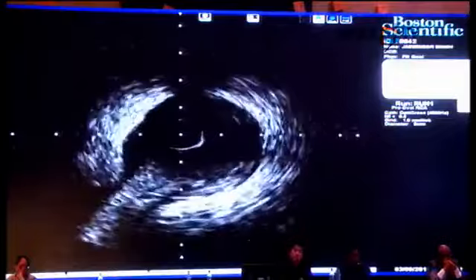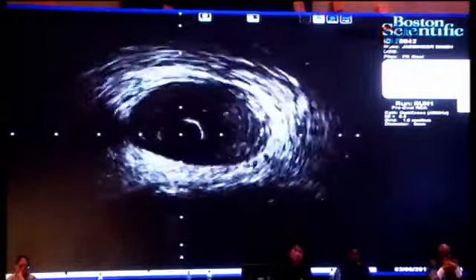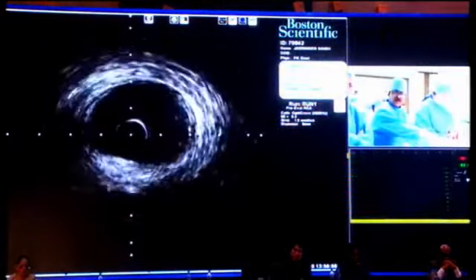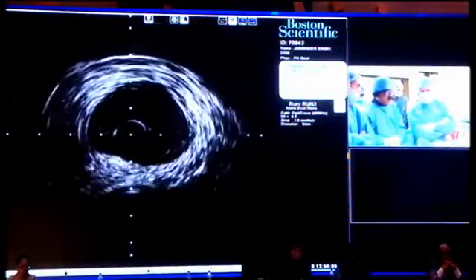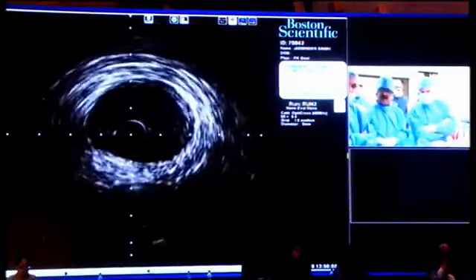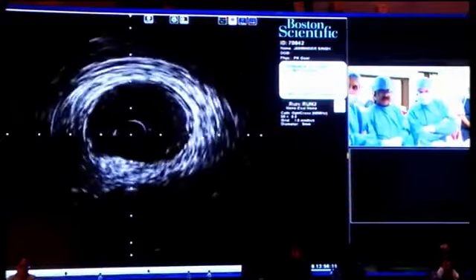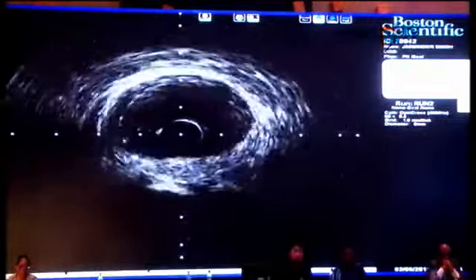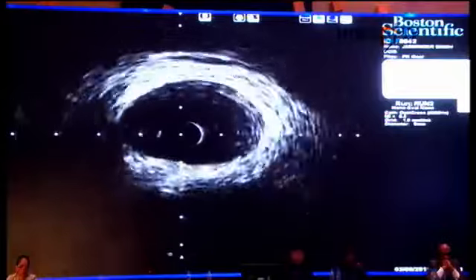So that is in the PDA? That's definitely in the PDA. Let's make a pullback. You make a pullback. So now you see the PDA is about 1, 2, 3. It's at least 3. Huge PDA. 1, 2, 3, 3.5 rather, I don't know. It's at least 3, yeah. So we are doing a pullback. It's moving slowly.